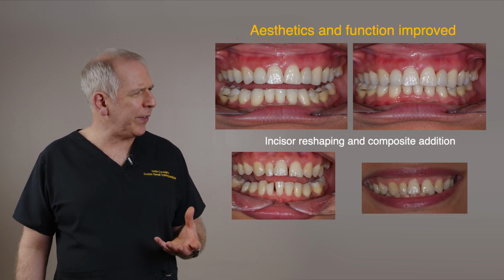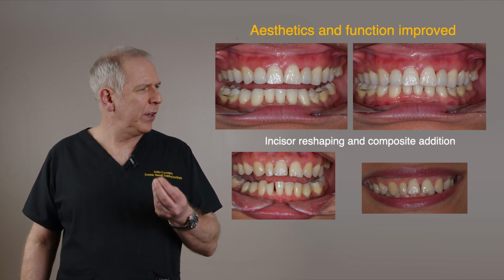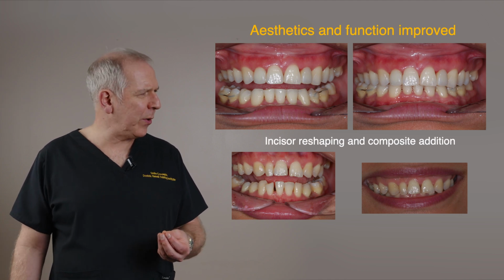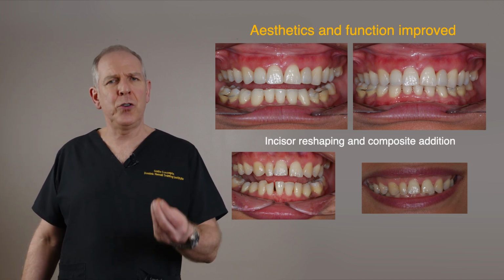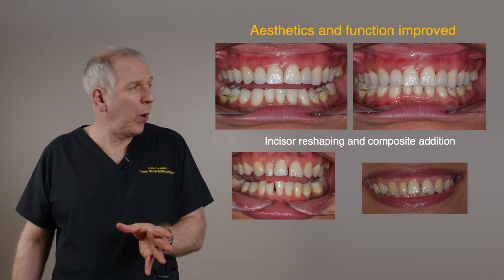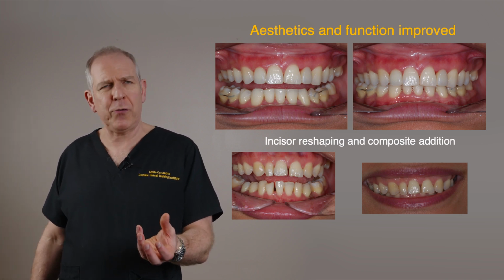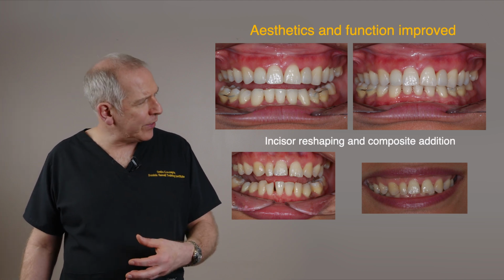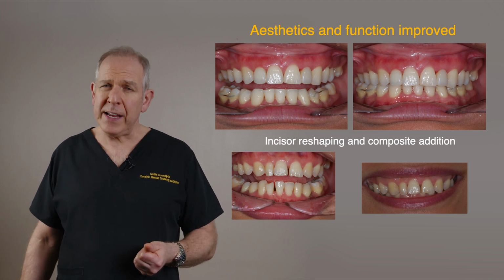So if you look at where we started from, bad occlusion, deep traumatic occlusion, tooth wear, it's really a case that it's only going to get worse. The orthodontics then sets us up with a good occlusion, but ideal spacing on the upper right 2. So what we can do with the upper right 2 then is do our very minimal all ceramic 360, which gives us a lovely result. And then on the left hand side, we have the zirconia adhesive bridge.